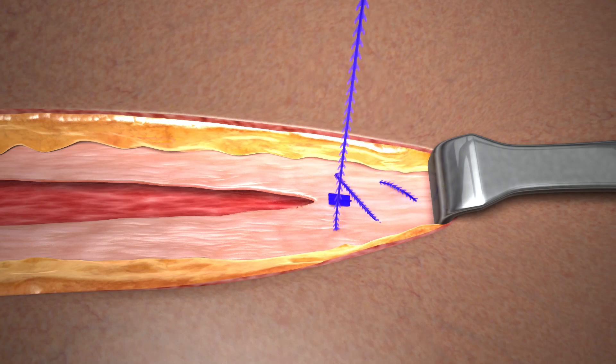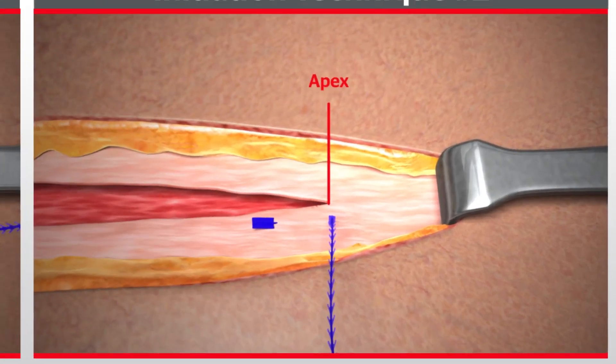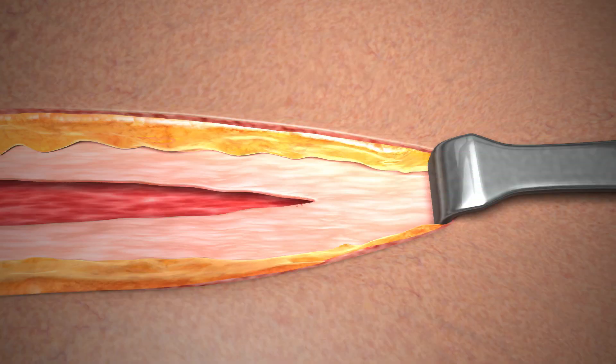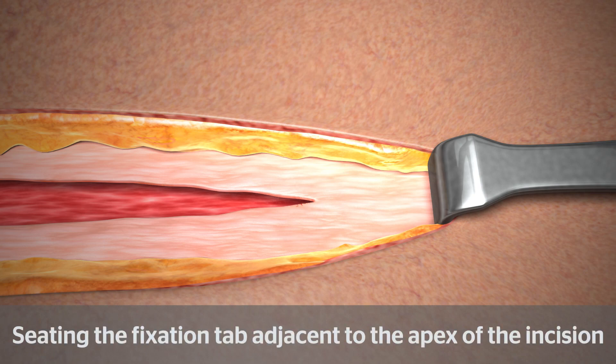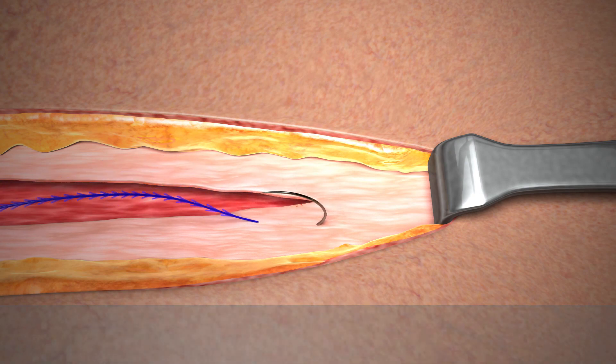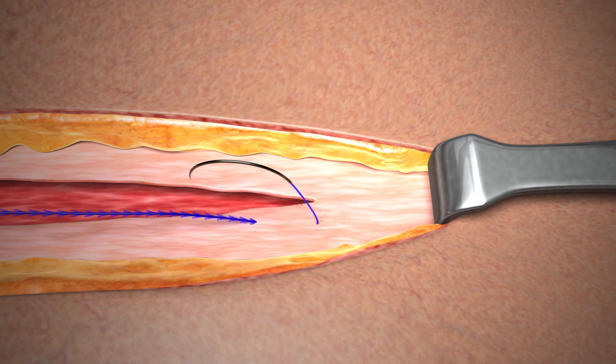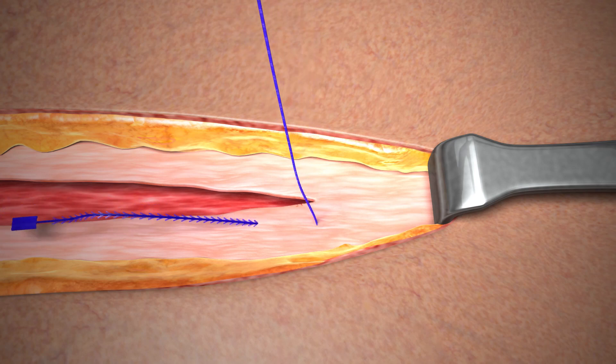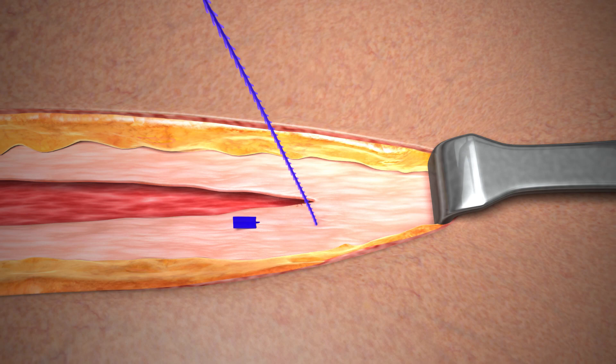Multiple passes are acceptable. Gently pull on the device to take up any slack. In the second technique, the fixation tab is seated adjacent to the apex of the incision. To seat the fixation tab, take the first pass in intact tissue adjacent to the apex in a direction away from the incision. Pull the device through the tissue to gently seat the fixation tab, which should remain visible above the intact tissue.